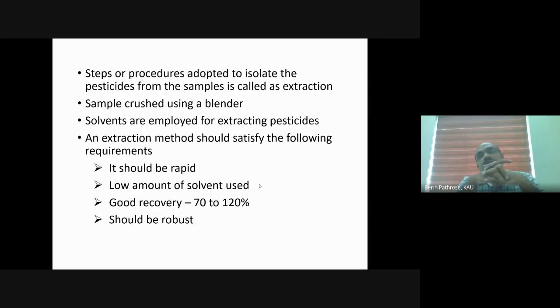The first thing we will do is the sample will be brought to the lab. In the lab we will cut it into pieces.